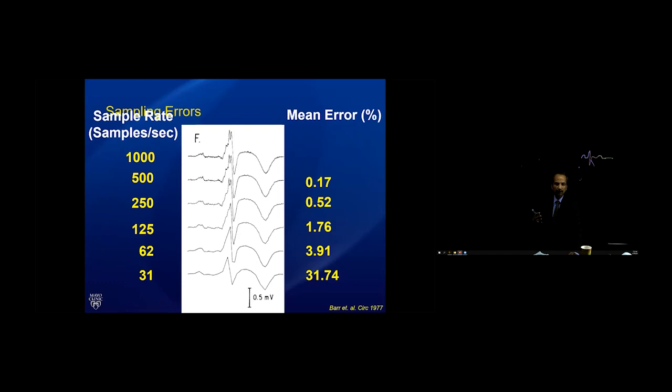What system do you want? And most of the time, you look at a lot of characteristics of how the map helps. But one of the fundamental things about the system is the frame rate. And this is an illustration. This is the same signal. But you can see when you have poor sampling rate, a lot of the things like what Dr.